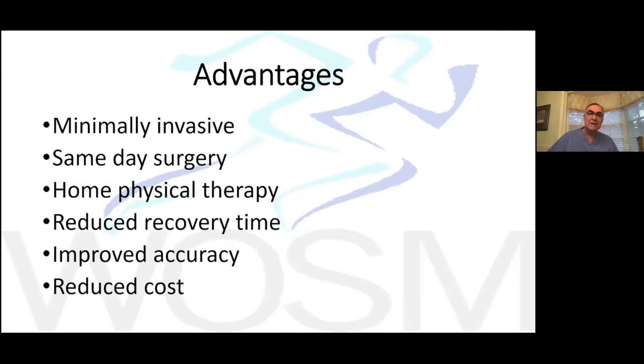One has a tendency to think of arthroplasty as all bone and cartilage and metal and polyethylene, which is the plastic component of the arthroplasty. And that is true, but that's not the complete picture. There's a substantial amount of soft tissue realignment and release that goes on, particularly if there is a significant deformity in a given patient's arthritic knee.